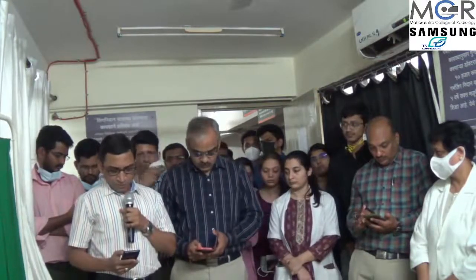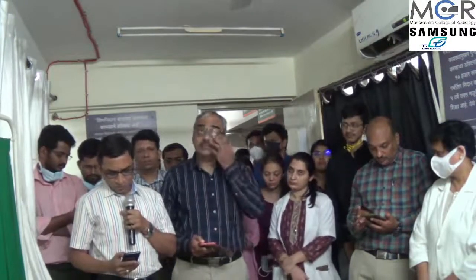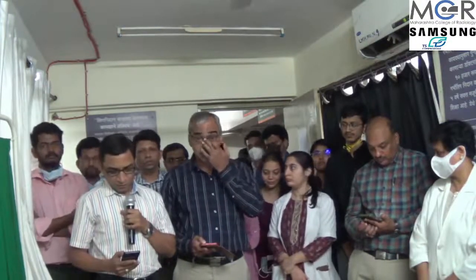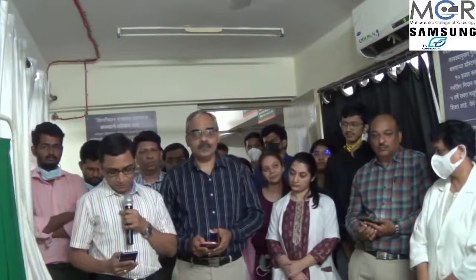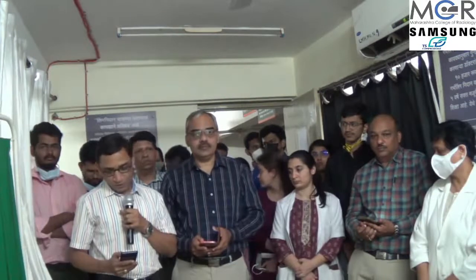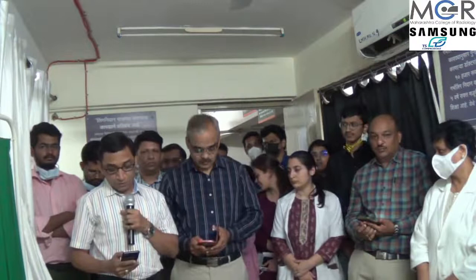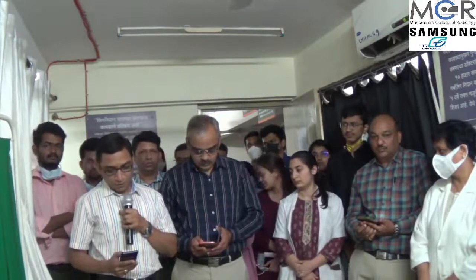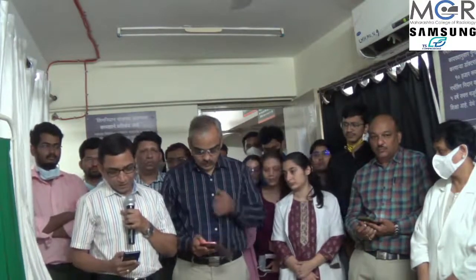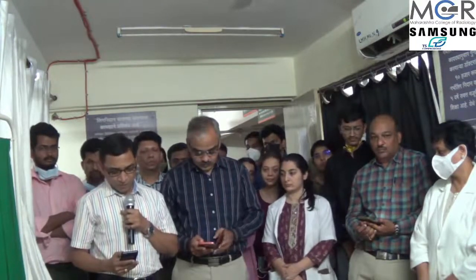The next question is, is calcification in postmenopausal ovaries abnormal? Do we need a follow-up? Dystrophic calcification in postmenopausal ovaries is considered normal unless there is an increase in the size of the ovary beyond the permissible limit, that is, more than 8 cc volume in a postmenopausal woman is considered abnormal. So if the ovarian volume is less than 8 cc, even if there is a calcification, it is considered a normal finding.